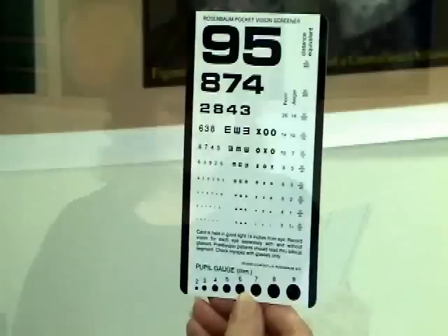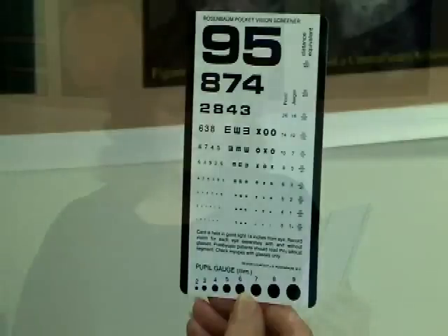Position the near card at the correct distance. Be sure the patient is wearing glasses normally used for reading. Test one eye at a time. If the patient is using glasses, use a tissue to block the vision in one eye in order to avoid smearing the glasses.